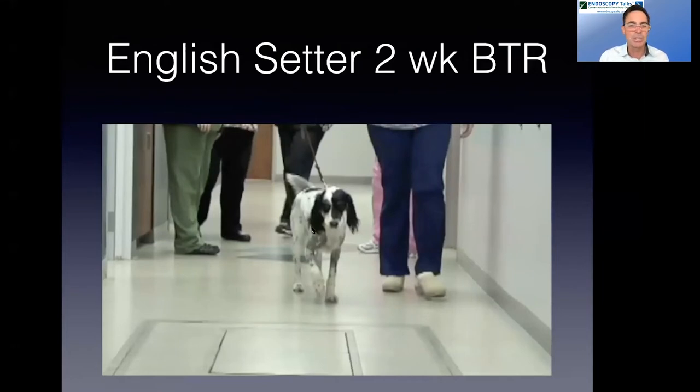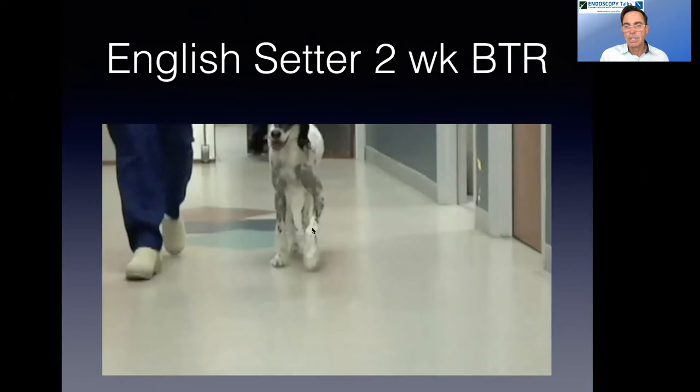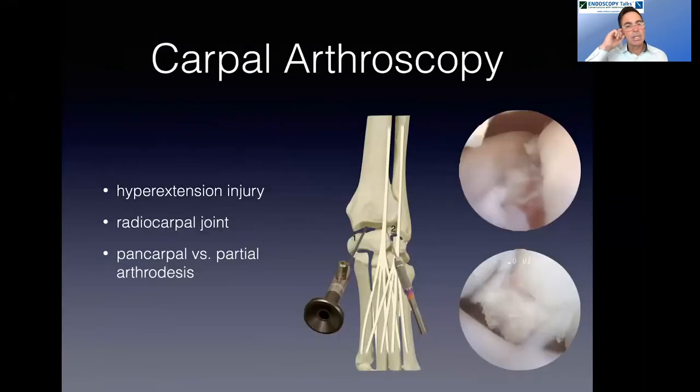And we also did a procedure called a biceps tendon release, which we'll sometimes do to take some of the stress off the medial compartment. So take a look at how non-invasive this procedure is. This is 2 weeks post-op. It's the left arm. No, it's not bad. So you can see in this case that the dog had both elbows operated, and 2 weeks after looks basically normal because we didn't have to go in and do a lot of trauma to the joint capsule or soft tissues around the joint.